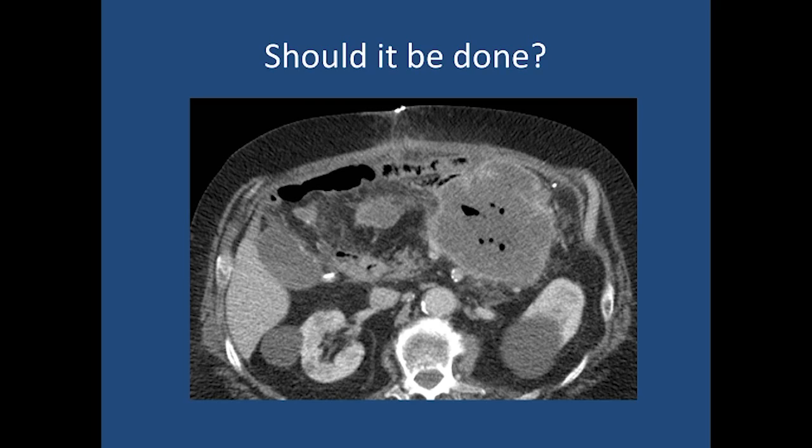In this particular example, note that the wall is quite thick and irregular. This is an example of a tumor abscess, and as such, we do not expect that this cavity will involute in the same manner as, say, a diverticulitis-related abscess. Because it won't necessarily involute, once the catheter is taken out, there is a high likelihood that the abscess will reaccumulate. As such, abscess drains placed in these examples might become lifelong catheter placements, and this kind of situation should be discussed with the patient and the referring provider before consideration of placement of a catheter.